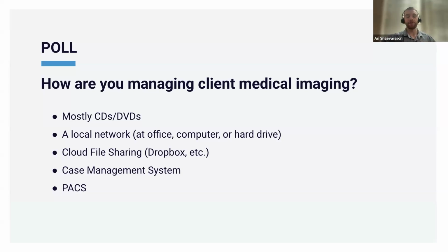What are your thoughts on those results? Again, not that surprising. I guess the only surprise is that nobody said PACS, but that may be because they don't really know what a PACS means, and we can get into that in more detail in this webinar. But the vast majority of the way that people use medical images today is still on CDs, so not a big surprise there. File sharing systems like Dropbox and Box.net have become very popular. There's a little bit of a caveat with that one. So one, you're probably not seeing something in DICOM format there.